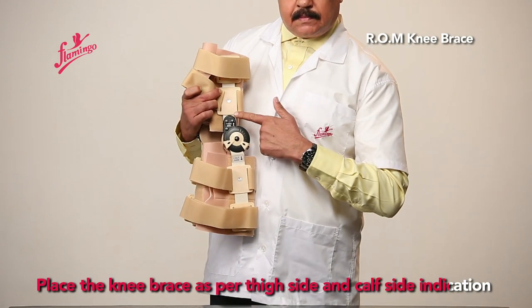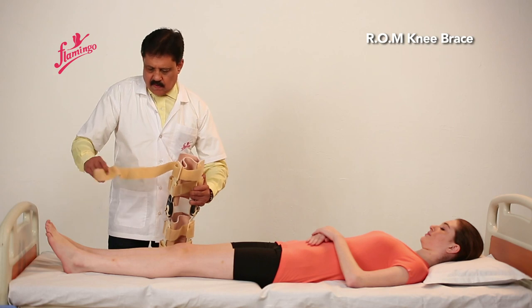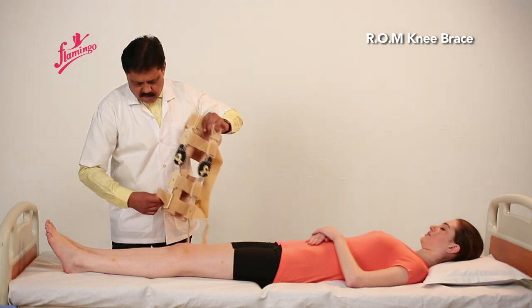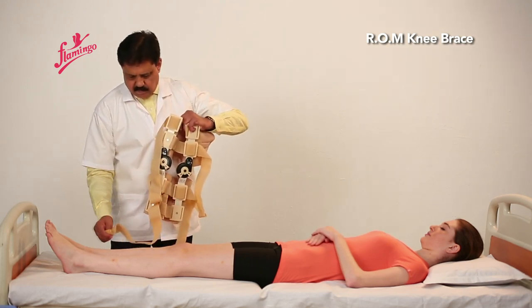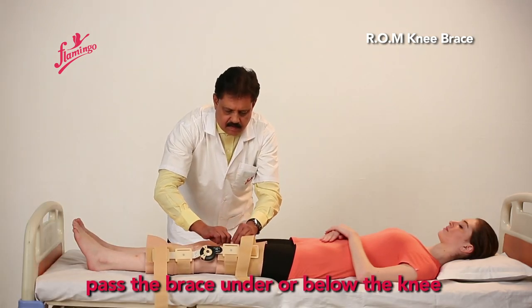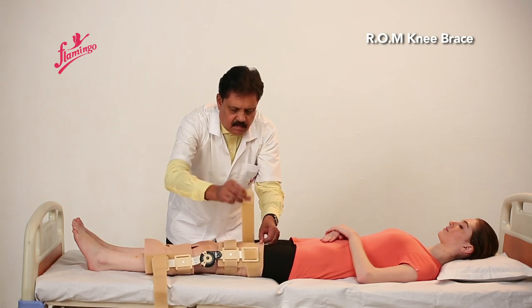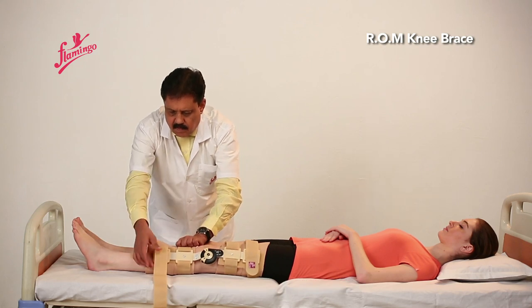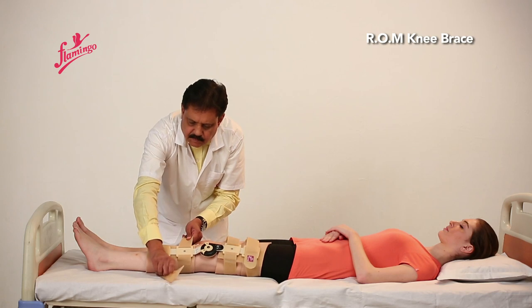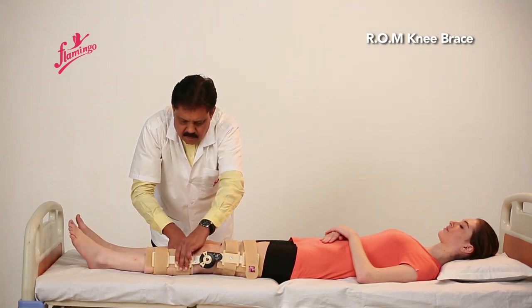Place the knee brace as per thigh side and calf side indication. Open the brace. Press the brace under or below the knee. Pass the straps from the ring. Tighten the lower straps, followed by the upper straps.